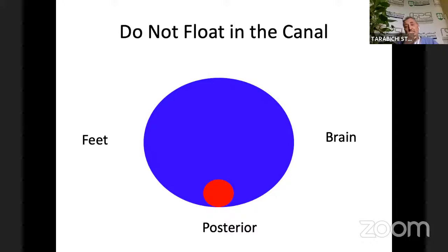I usually anchor the endoscope towards the back of the ear canal, and I find that very useful in terms of the stability of the image. I also find it very useful because I straighten out the ear canal, so I can introduce instruments in this space, and it aligns. If you push down on the cartilaginous ear canal, you end up aligning the bony and the cartilaginous ear canal.